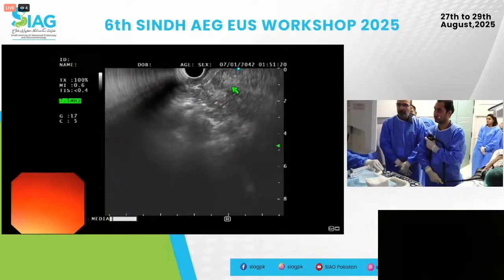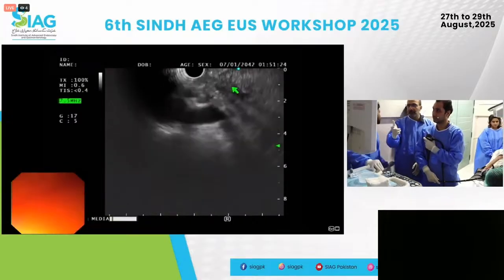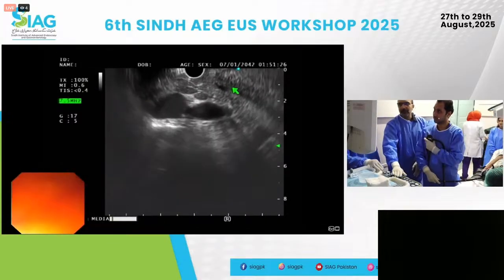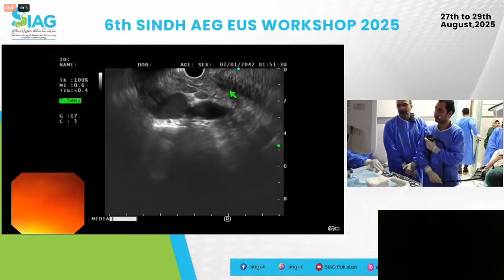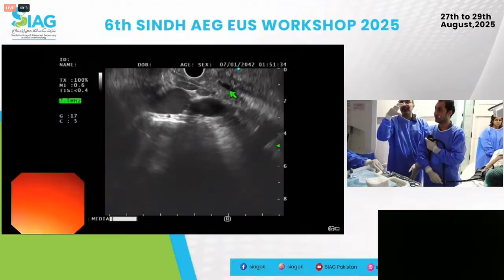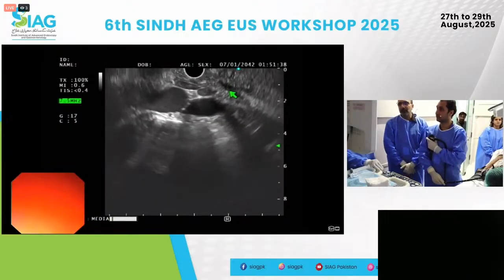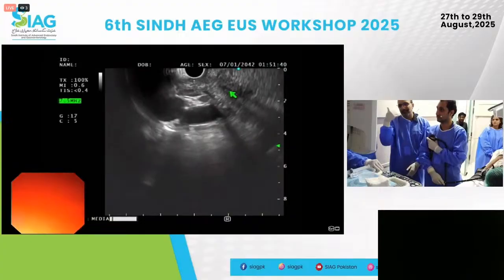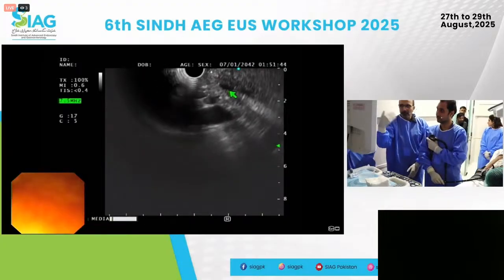Good. Counter. Big wheel towards your sections. Yeah, there you go. Okay, there's your PD. Yes. Sorry. Go counter. What about the big wheel up and down? Yeah, in this position, I guess you relax the big wheel, right? Big wheel away from you, which is my way of saying relax. Big wheel away from you. Good. And now go counter some more.